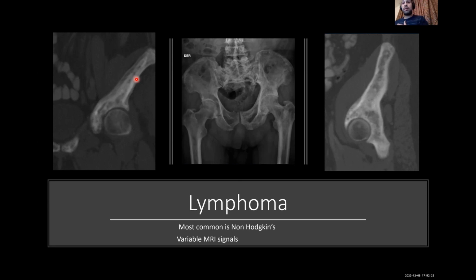I told you something a few moments ago and another thing now, so nobody can say unless the other factors are ruled out. In one of my cases there was a lesion like that, and I called it Paget, but it was associated with a soft tissue component, was biopsied, and was lymphoma. So lymphoma should be reserved in your mind all the time.